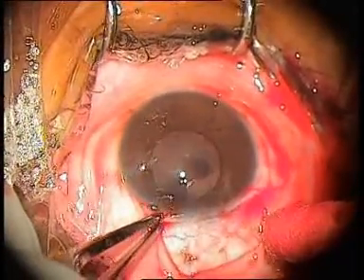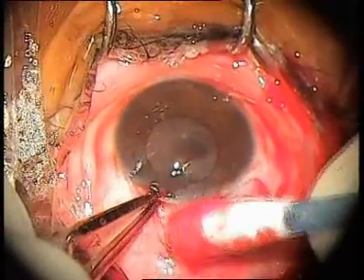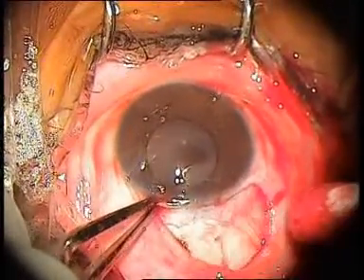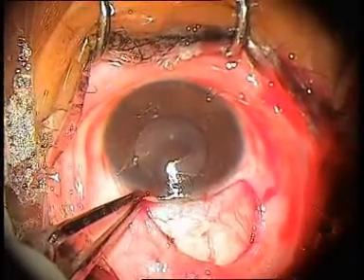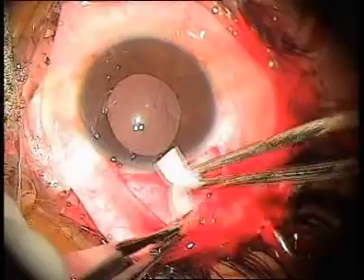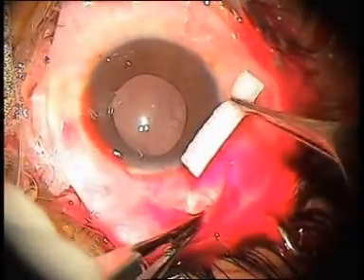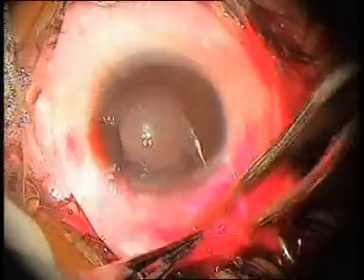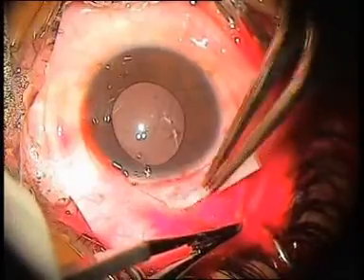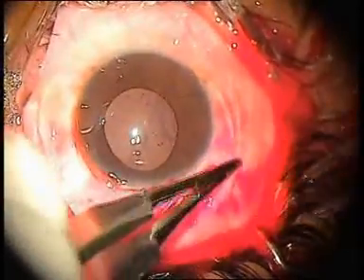After raising a fornix-based conjunctival flap, bleeders are cauterized by gentle cautery, taking care not to char the tissues. A 0.2 mg per ml mitomycin C soaked microsurgical sponge is placed under the conjunctival flap and left under for a duration of 2 minutes.